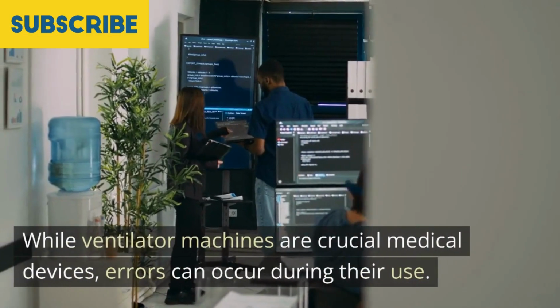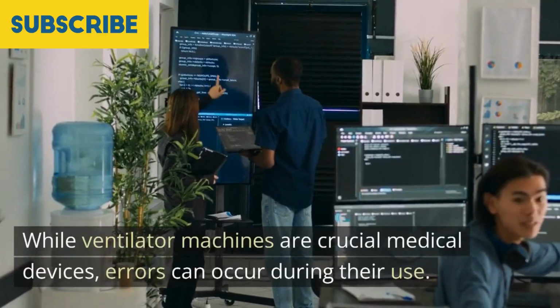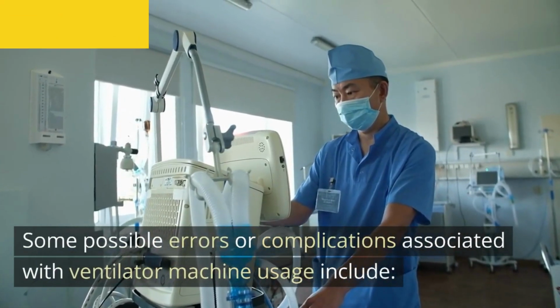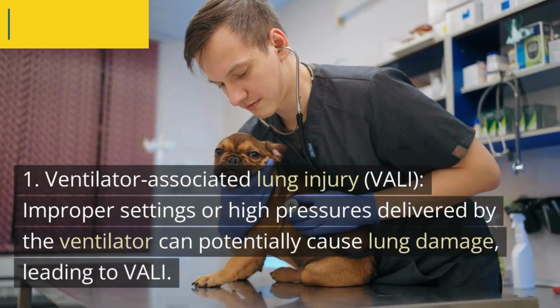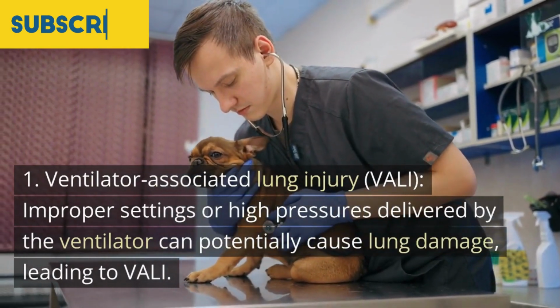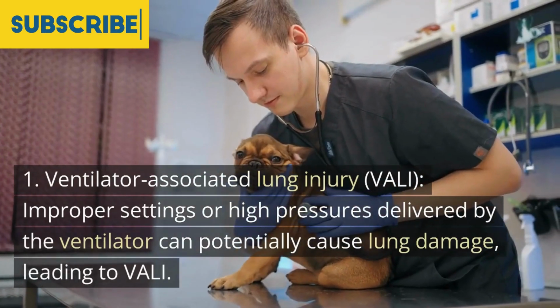While ventilator machines are crucial medical devices, errors can occur during their use. Some possible errors or complications associated with ventilator machine usage include: 1. Ventilator-associated lung injury, VALI. Improper settings or high pressures delivered by the ventilator can potentially cause lung damage, leading to VALI.